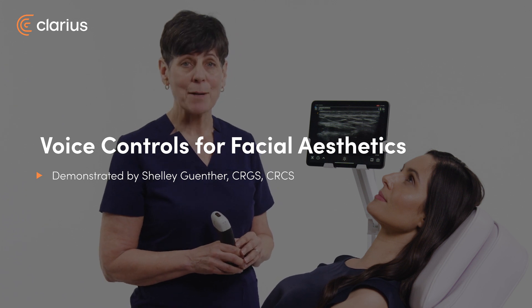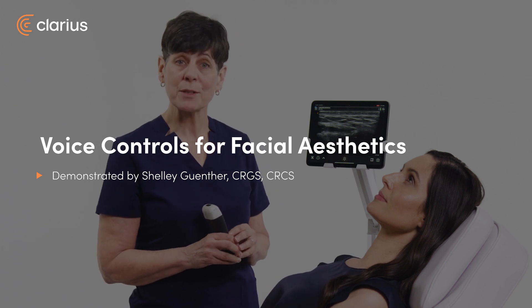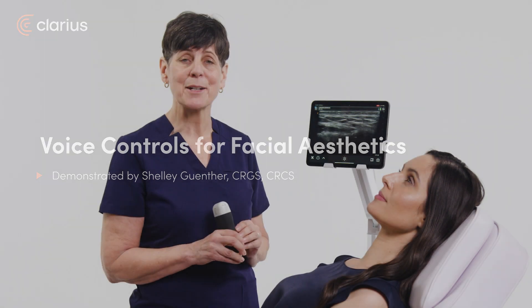Hi, my name is Shelley and today I'm going to show you how you can use the voice control feature with your Clarius scanner. This will allow you to control key imaging adjustments such as gain, depth, and capturing an image — all without touching the screen of your device — leaving your hands free to focus on your patient and the procedure.